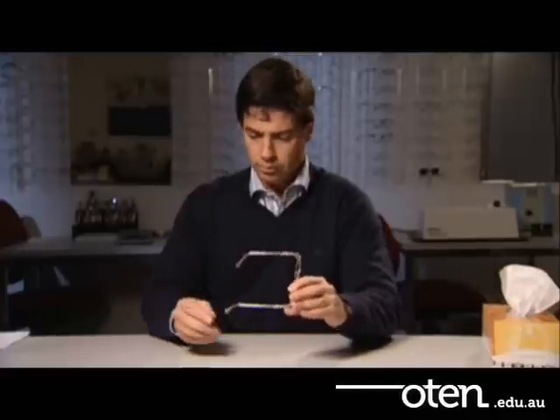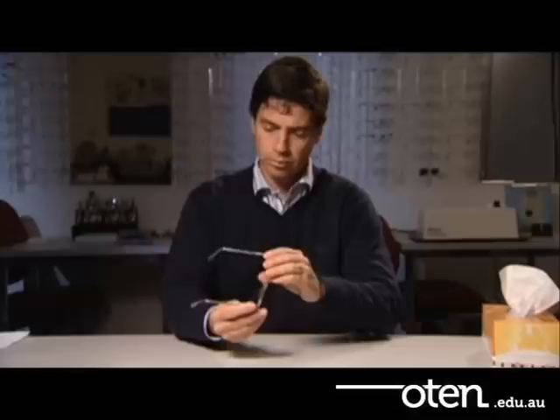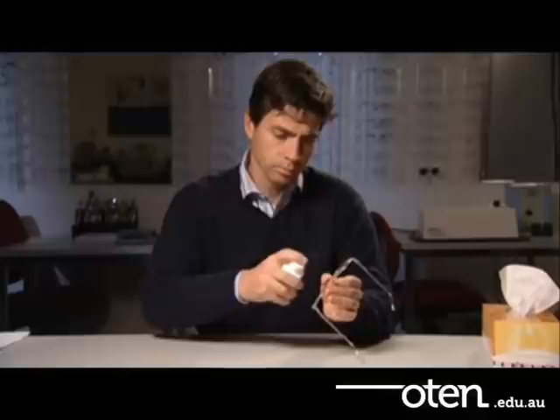Finally, take another good look and overview the frame. It should look evenly balanced from every aspect. Also, make sure that it's clean.